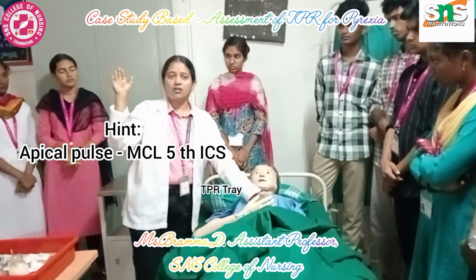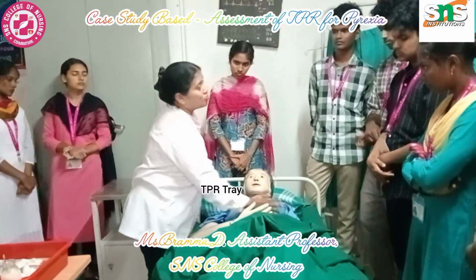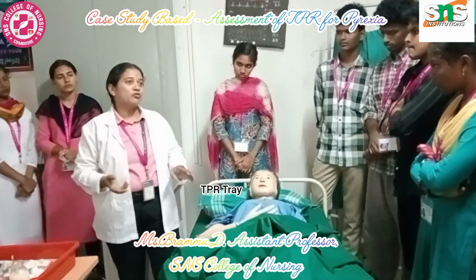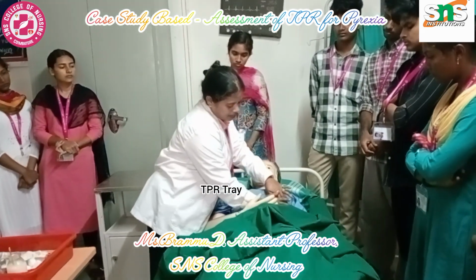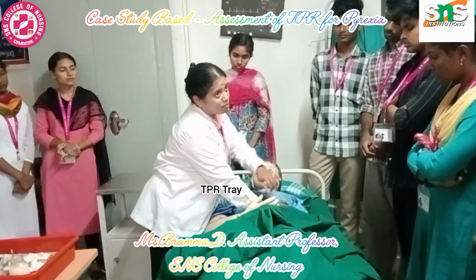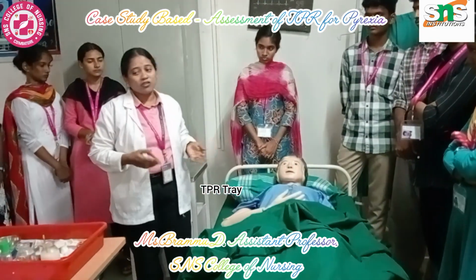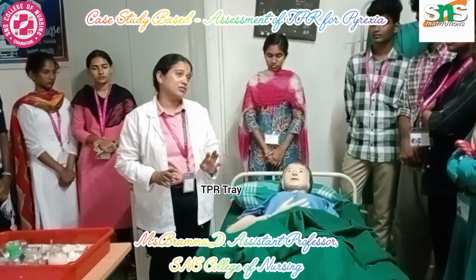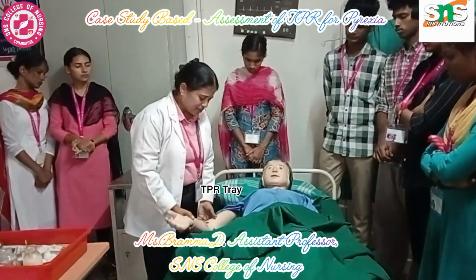Hold the full palm of the hand and place it. If it is a female patient, don't put it onto the breast tissue, or you will have a wrong result. One hand must displace the breast away, and you can put it on the apical pulse, which can be palpated for 1 full minute. If the patient is feeling discomfort, you can use the stethoscope and directly place it onto the 5th intercostal space, mid clavicular line.